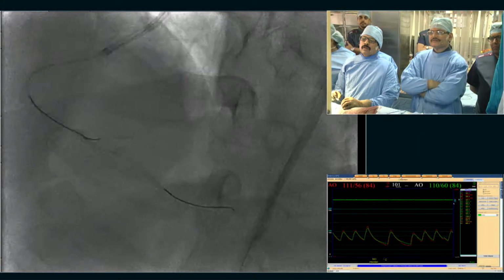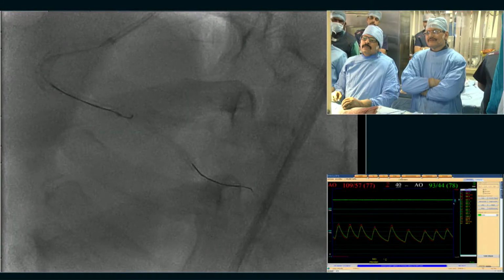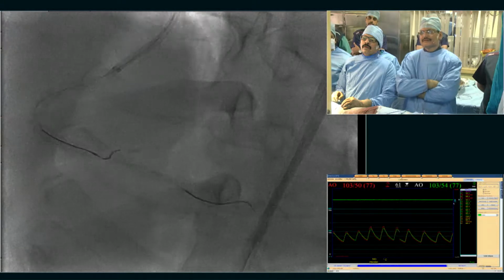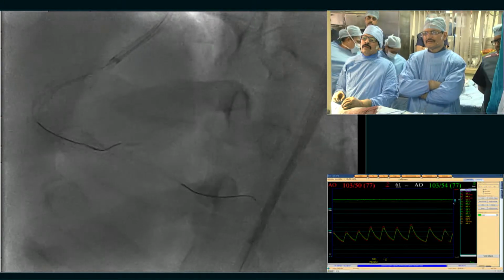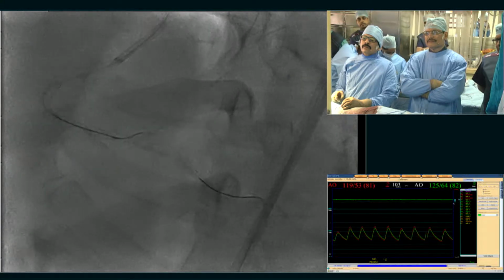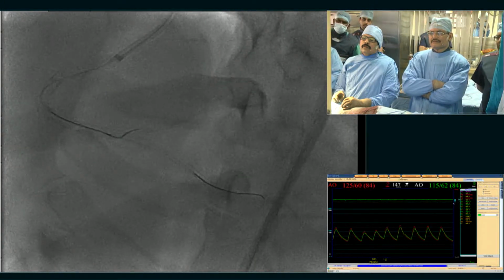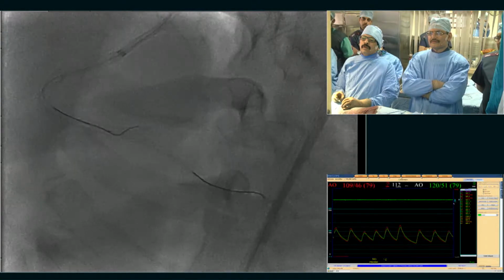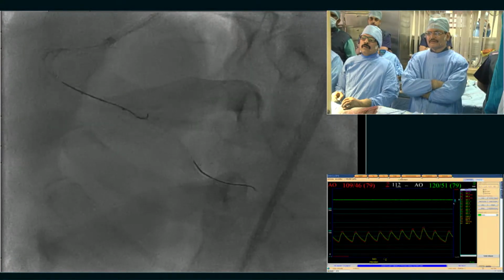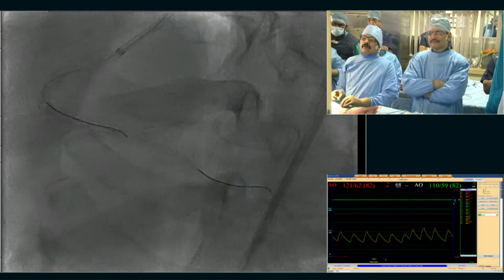Yes, I think we have a great learning case here. I think first of all, this is a previous stent. It went. So we have a previous angiogram. Yes. So we should have seen that previous angiogram. Sure. So we know really how the distal looks and what was the end result before, and so we plan. So proper planning for the case is the key to success. And remember, my teacher always told me that you have to have plan A, plan B, prepare the case well. And this is where maybe we have not seen the distal properly before we started putting another stent, where we made our life now more complicated. But this is a good learning case because we learn from these cases. Yes. And this is why we are presenting these.